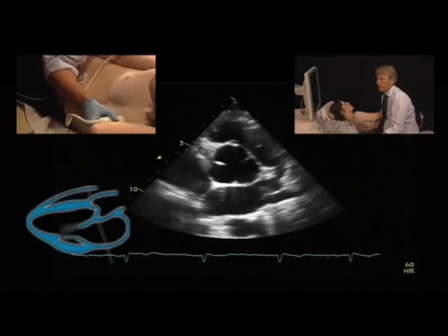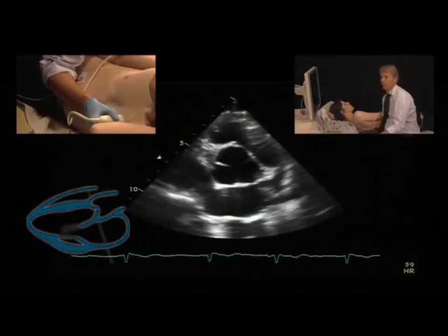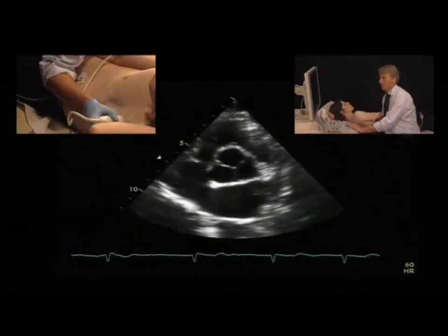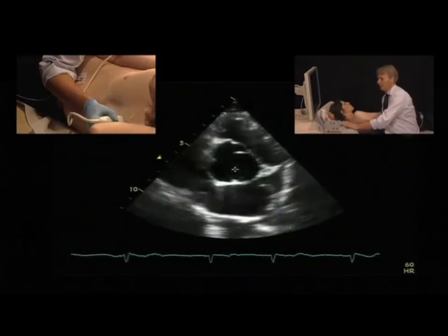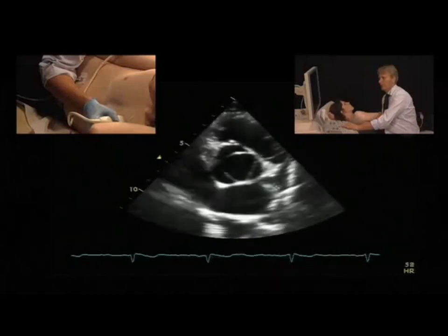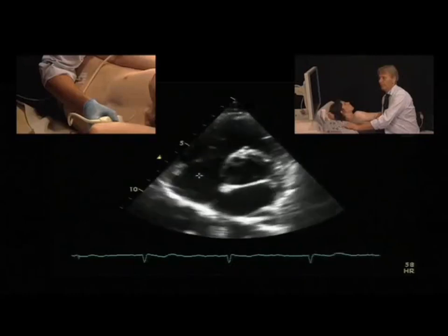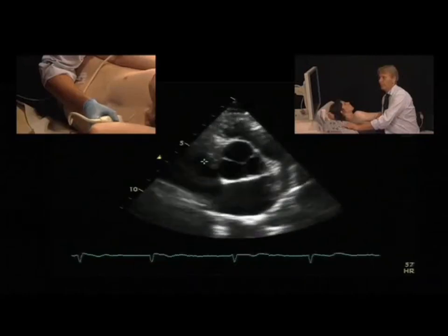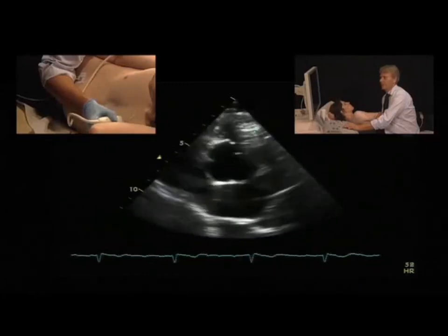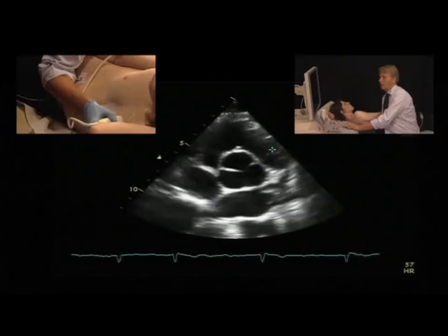We can cut the short axis at different levels. This would be the level of the base of the heart, where we can see the aortic valve. This is the aortic valve, we can see the left atrium, in this case with left atrial appendage, the interatrial septum, the right atrium, the tricuspid valve, the right ventricle, and the right ventricular outflow tract with the pulmonic valve. We can also see certain details.